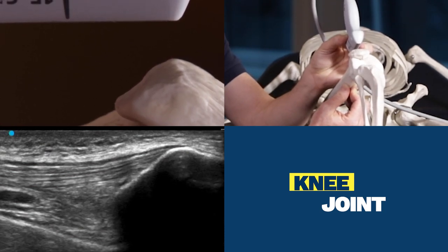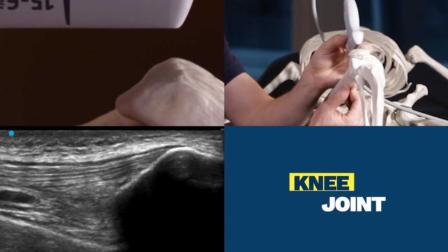The area of interest is going to be the hypoechoic, or very dark, area between the two fat pads that we'll show on the screen shortly. That's how we scan for the suprapatellar recess of the knee joint, which is how you get an injection into the knee joint fluid.